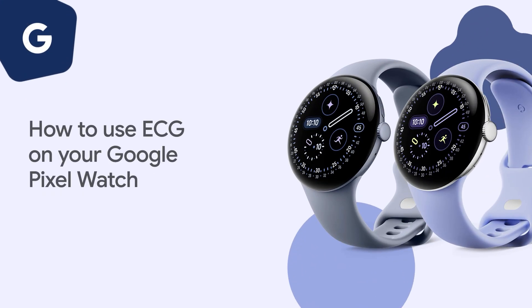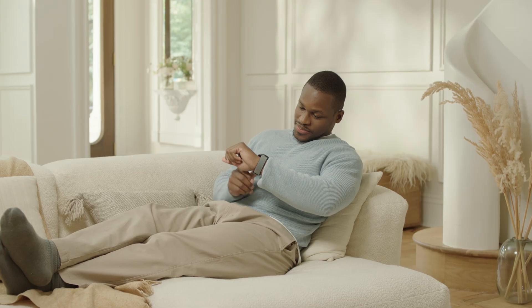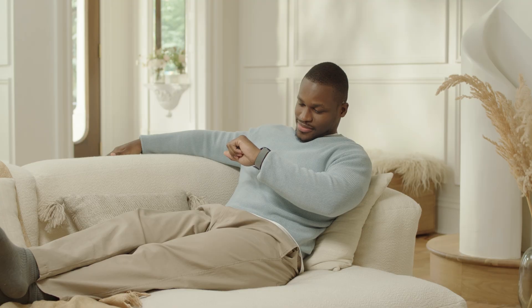How to use ECG on your Google Pixel Watch. When you use the ECG electrocardiogram app on your Google Pixel Watch, you can assess your heart rhythm for atrial fibrillation and then share your results with your doctor.